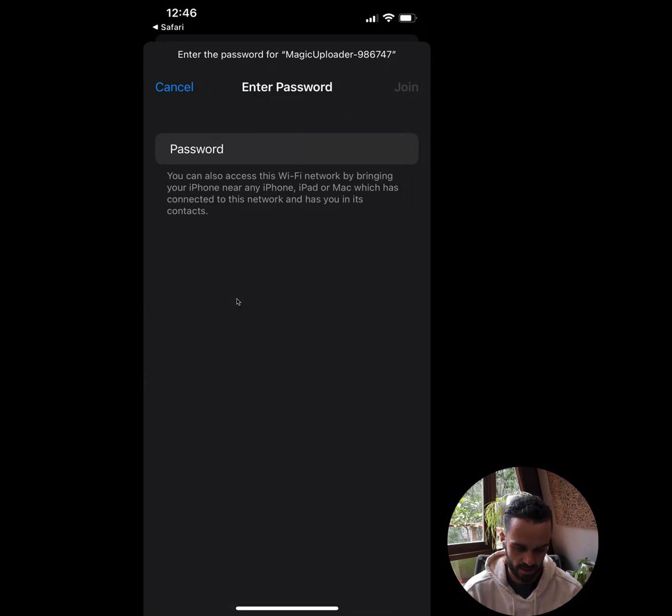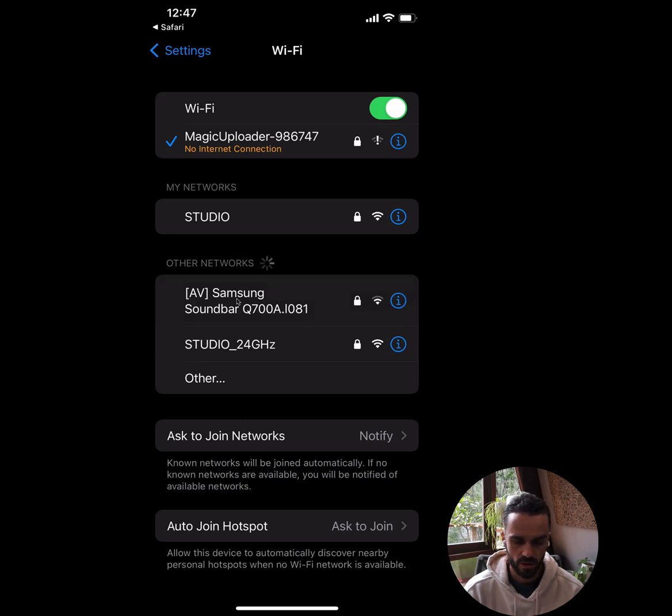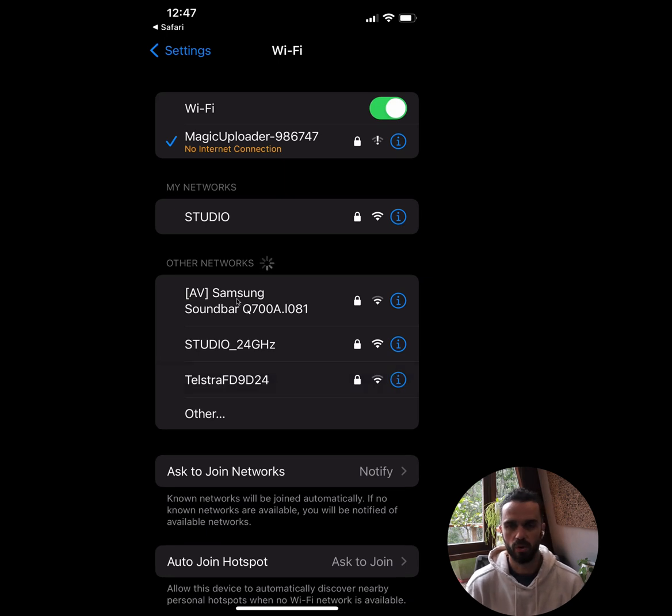It's asked me to enter a password. The password is always 'configure,' so I'm going to enter that. Once I put that password in, my phone will connect up to the Magic Uploader's WiFi network. You'll notice it says it's connected to the Magic Uploader network but there's a little notice that says 'no internet connection.' Don't be alarmed — that's how it's supposed to work. The Magic Uploader broadcasts its own WiFi network that is not connected to the internet, so your phone may warn you about no internet connection. That's okay.